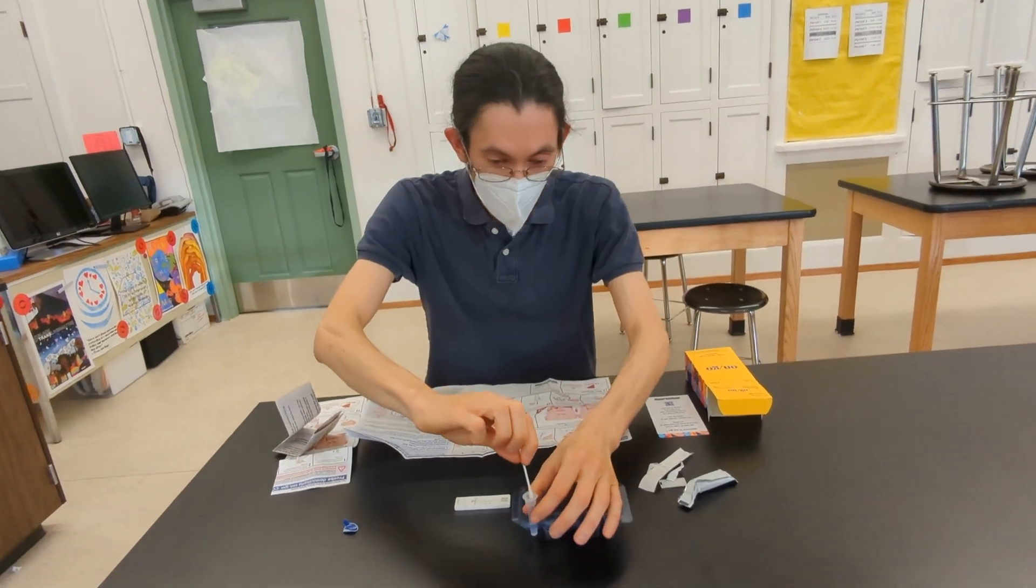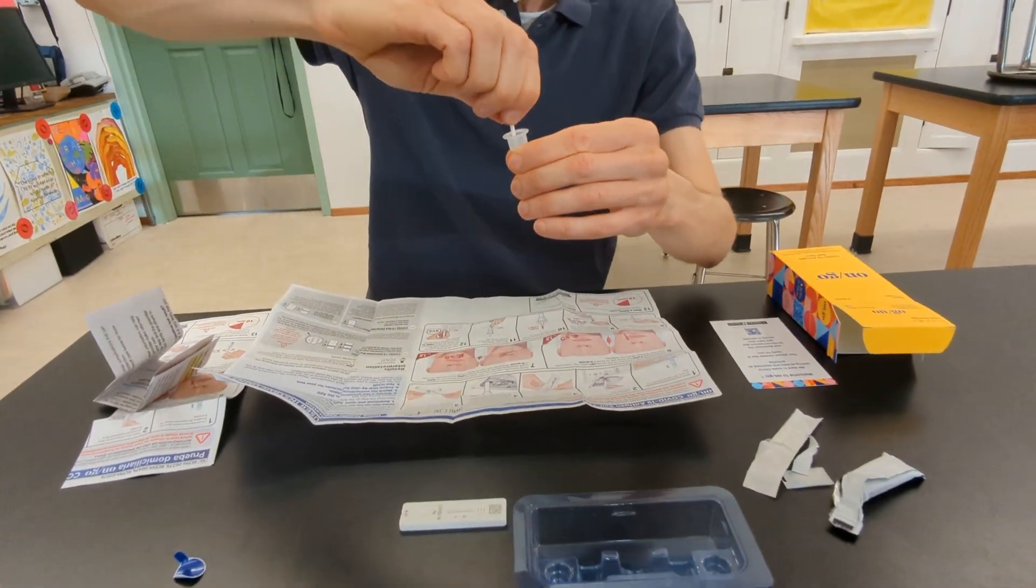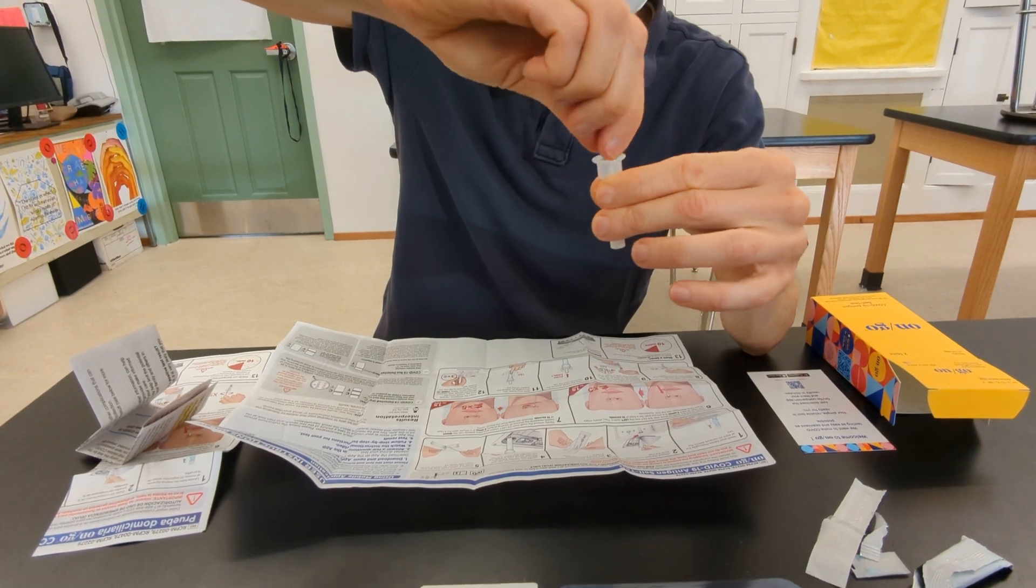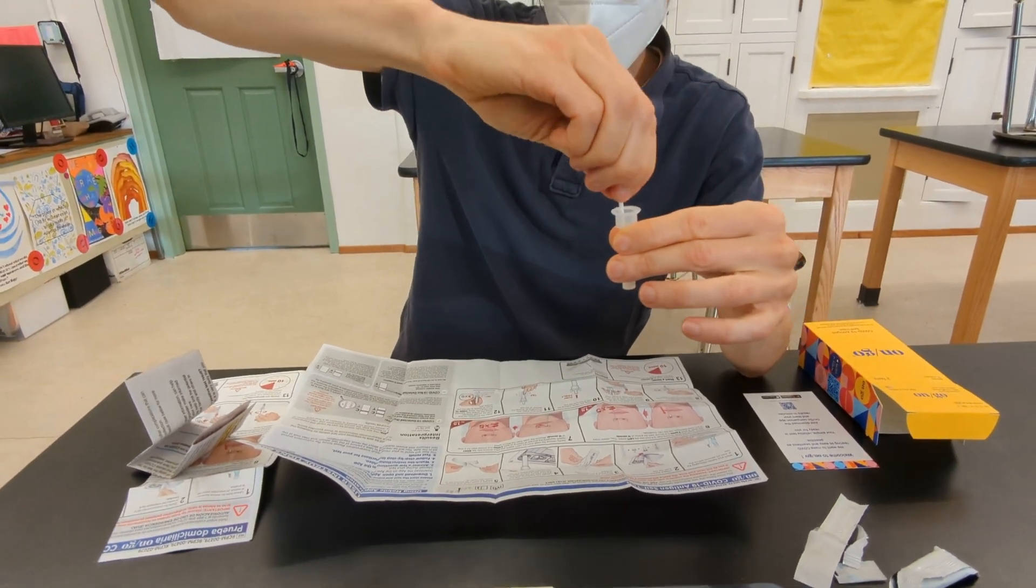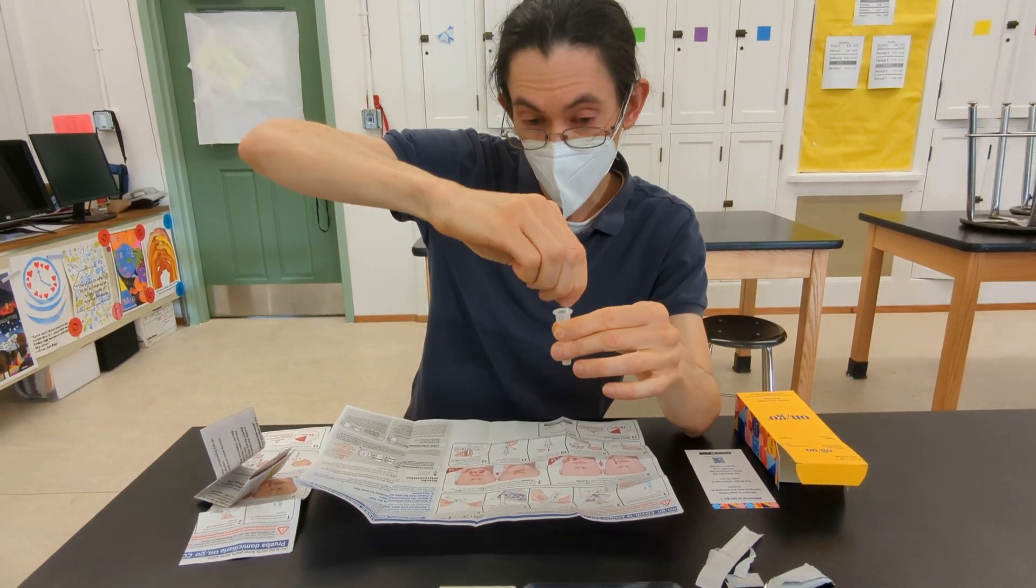You're going to place the swab in the extraction vial and swirl it around about five times vigorously. You're trying to get the materials from your swab into the liquid.